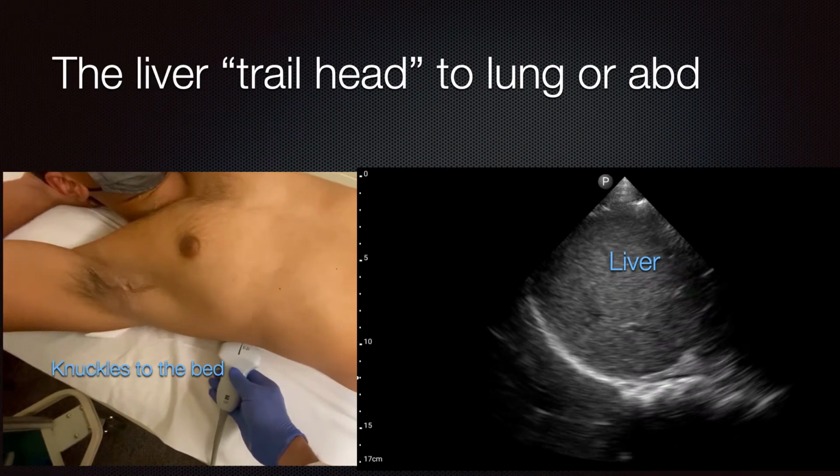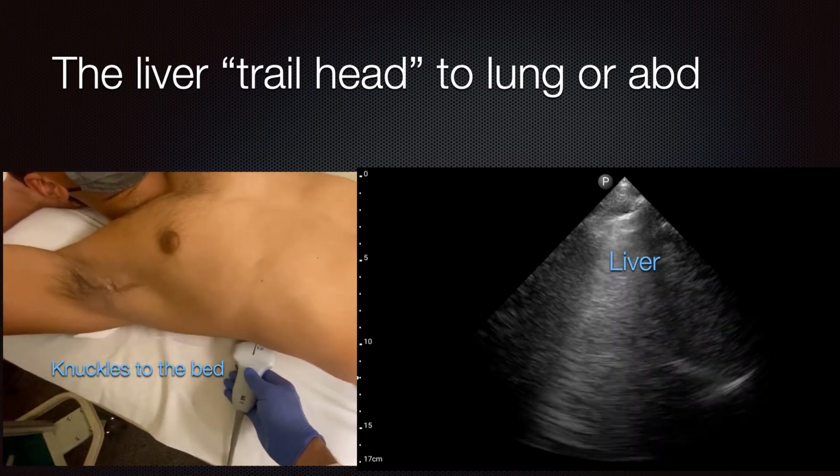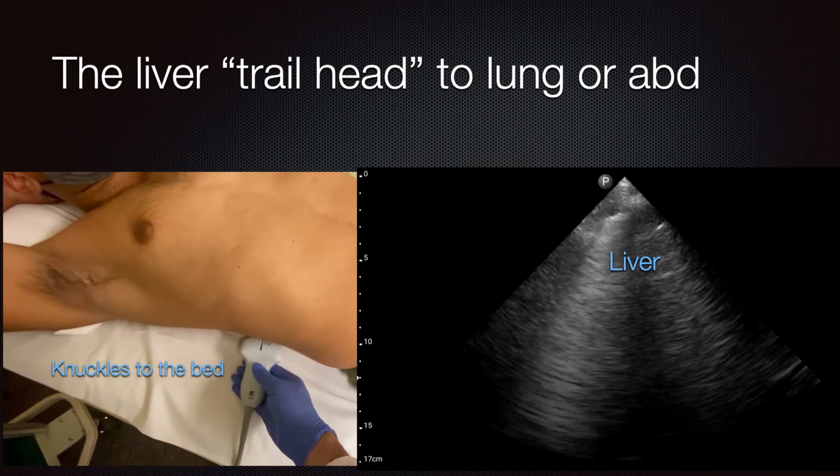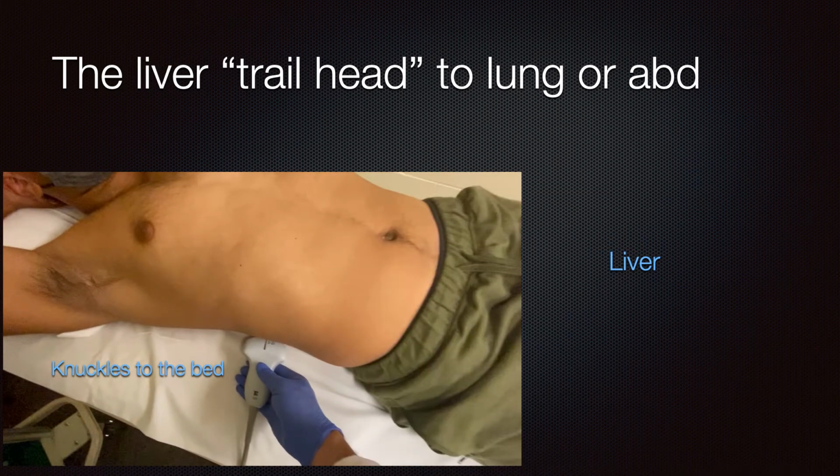So I always recommend you start at the liver, especially in an obese patient. Sometimes it's hard to identify landmarks, so I just start at the liver if the patient's lying in bed, and just with your knuckles to the bed, slide gradually up towards the axilla, and you'll usually be able to identify pathologies at the lung base there.